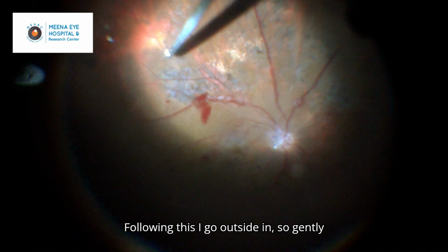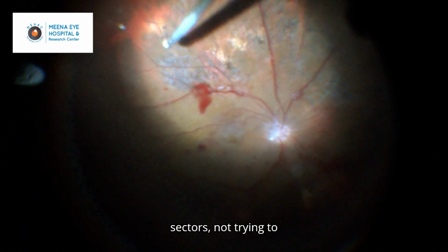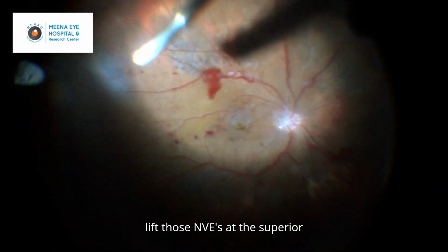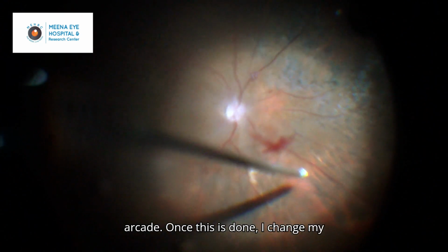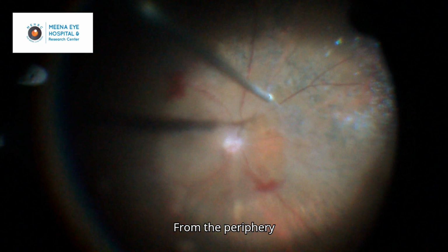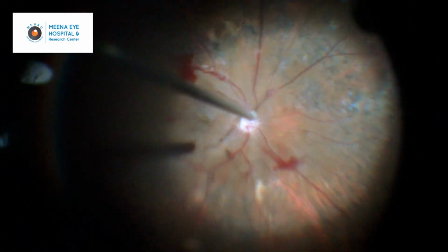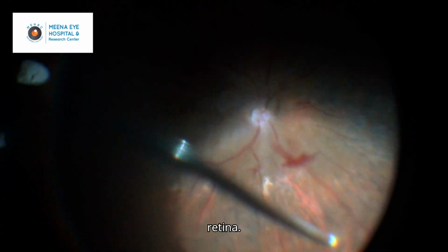Following this, I go outside in, so gently I am inducing the PVD in small sectors, not trying to lift those NVs at the superior arcade. Once this is done, I change my hand, induce PVD from the periphery and clear each segment of the retina.